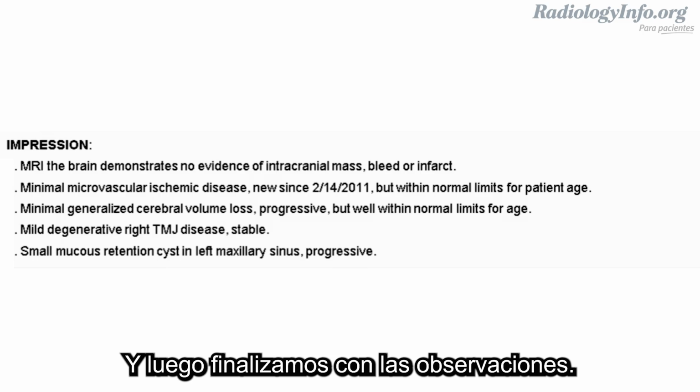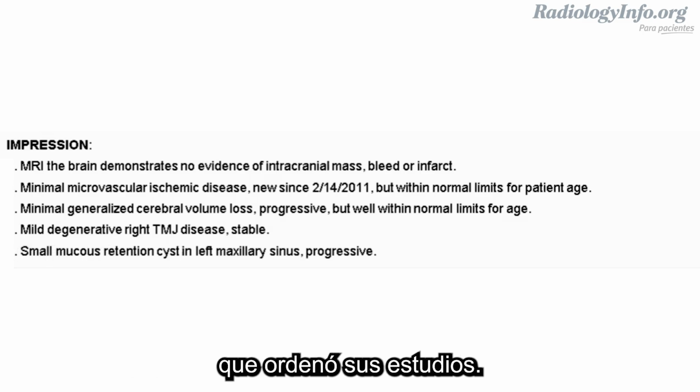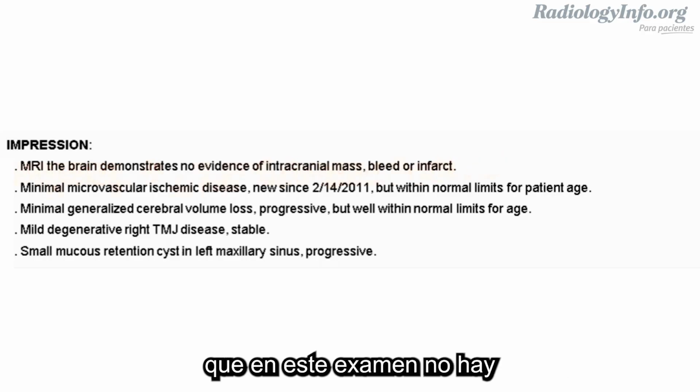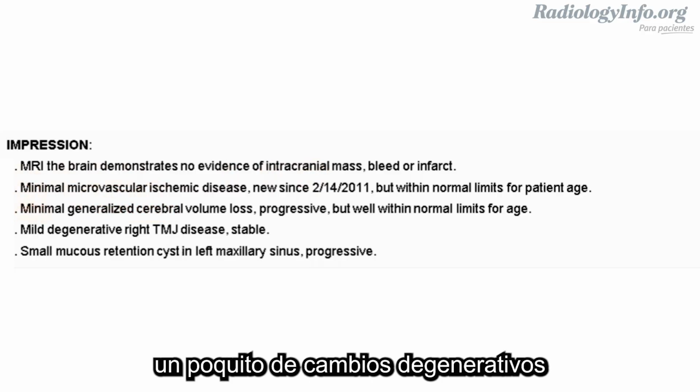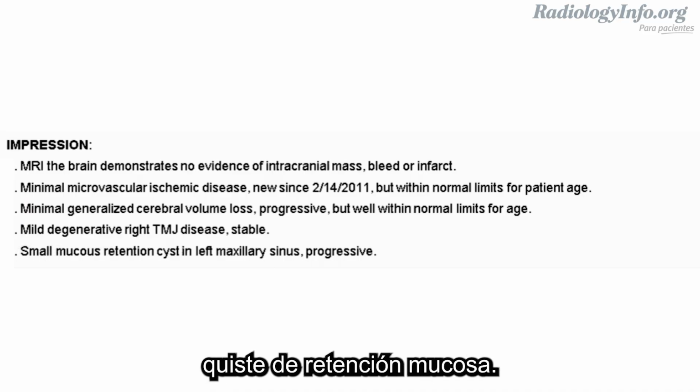And then we finish off with the impression. These are the important points that we want to convey to your referrer. So here are the pertinent negatives, that we didn't see a mass, bleed or infarct. Basically what we're saying is there's nothing really to worry about on this exam. The microvascular ischemic disease and volume loss were normal for age, with a little bit of degenerative change in one of the temporomandibular joints, and again, that small mucus retention cyst.